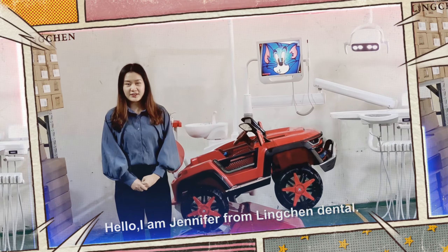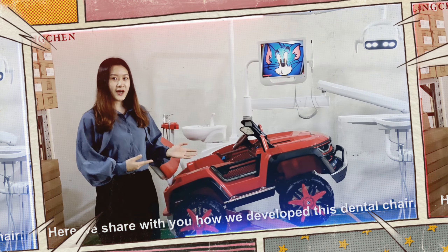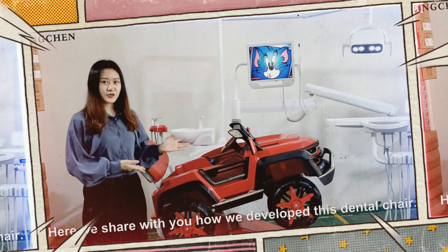Hello, I'm Jennifer from Berling Chan Dental. Here we share with you how we develop this dental chair.